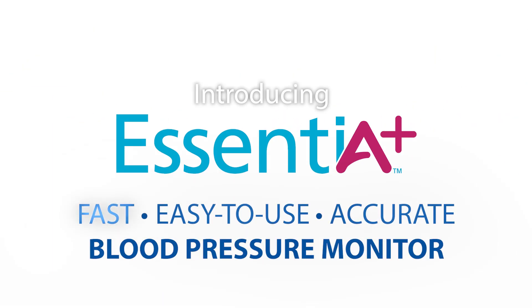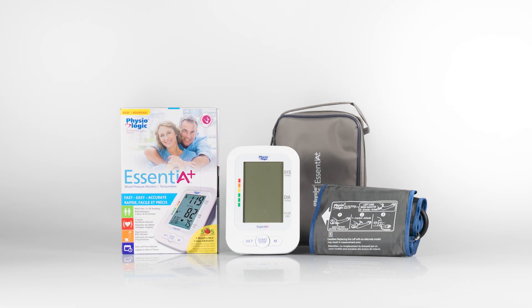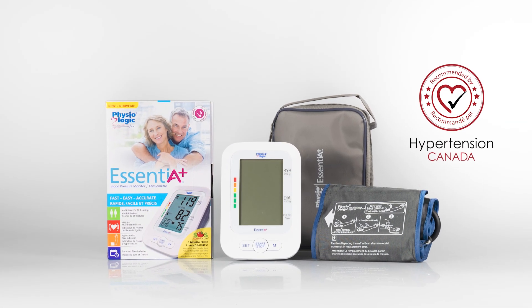Introducing Essentia Plus, the fast, easy-to-use, and accurate BP monitor. It comes with everything you need, and it is recommended by Hypertension Canada.